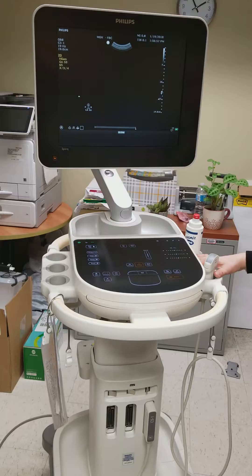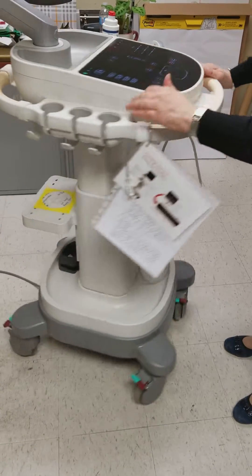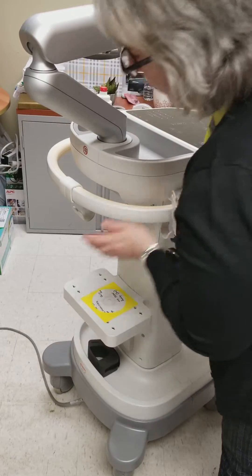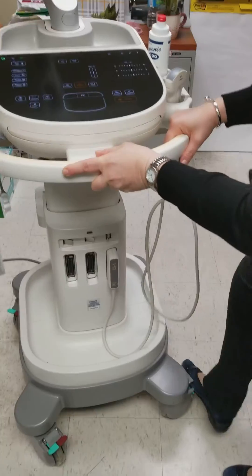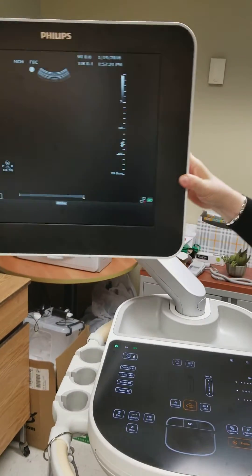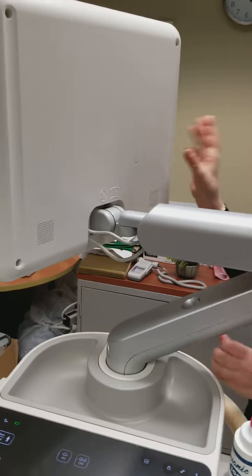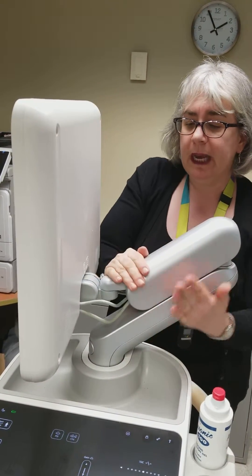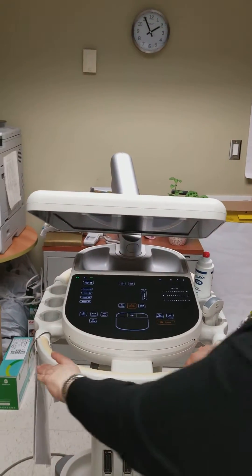When you're going to use the machine or move it from triage, you're going to unplug it. At the back there's an area to loop your cords, so you don't have to unplug it from the machine itself. If you're moving the machine, because this is an articulating arm, you don't want to be walking with it and have it swinging. Sandwich it between your hands, click it into place, and push the screen down so you can see over top of it as you're walking.